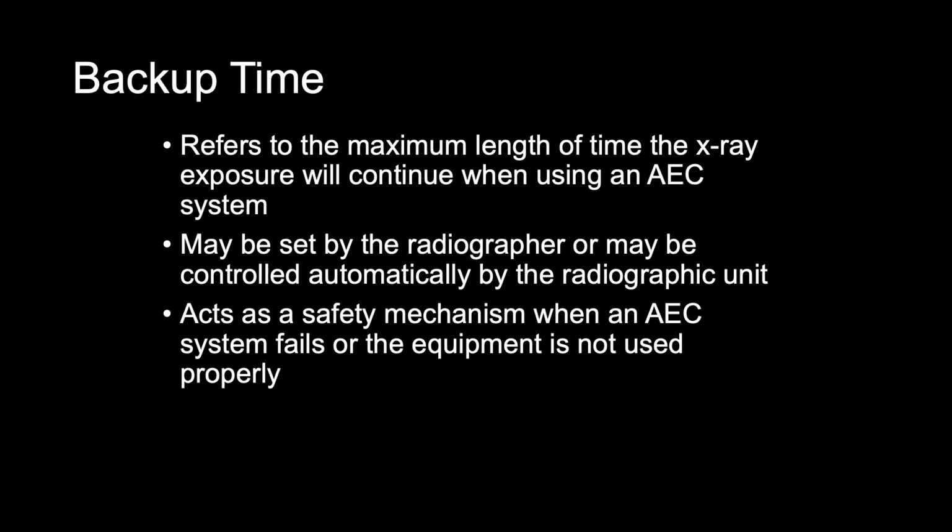Backup time is the maximum length of time the X-ray exposure continues when you're using an AEC system. The backup time may be set by us or may be controlled automatically by the radiographic unit. It may be set as a backup exposure time or as backup mAs, which is the product of mA and exposure time multiplied together.